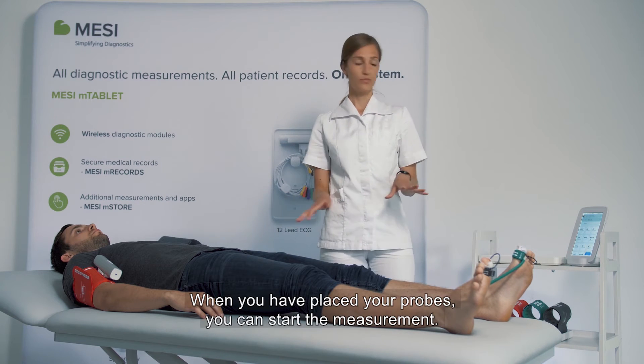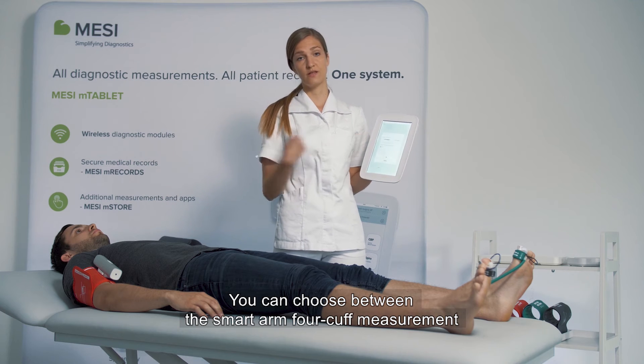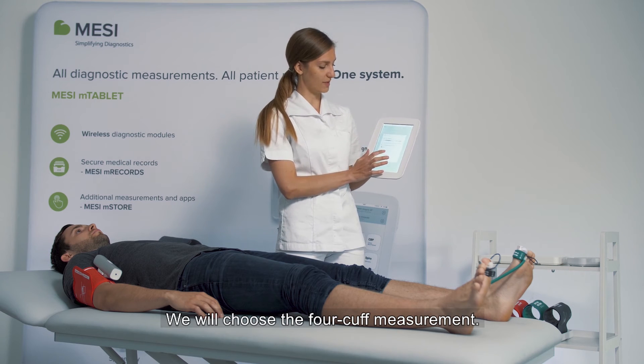When you have placed your probes, you can start with the measurement. You can choose between the smart arm four cuff measurement or a three cuff simultaneous measurement. We will choose the four cuff measurement.